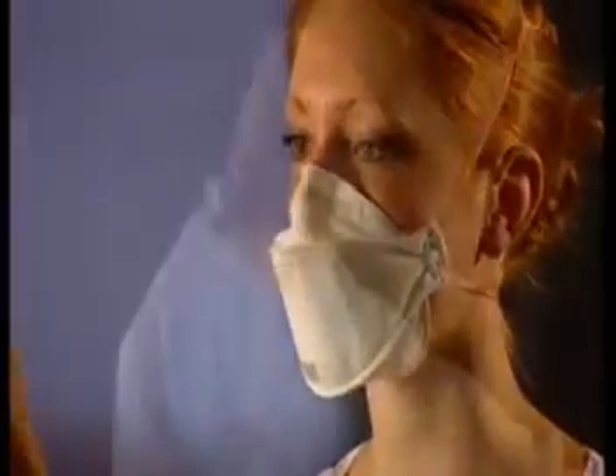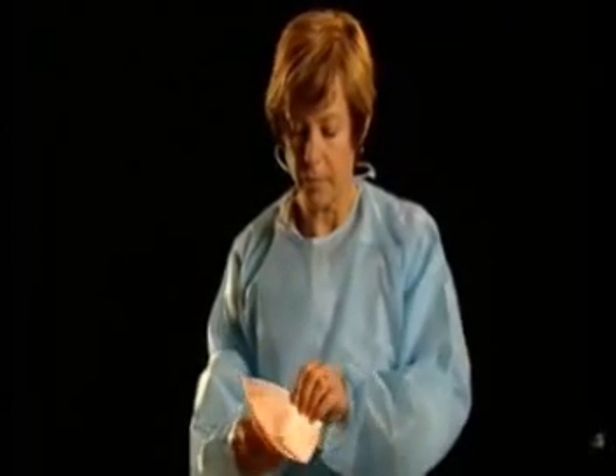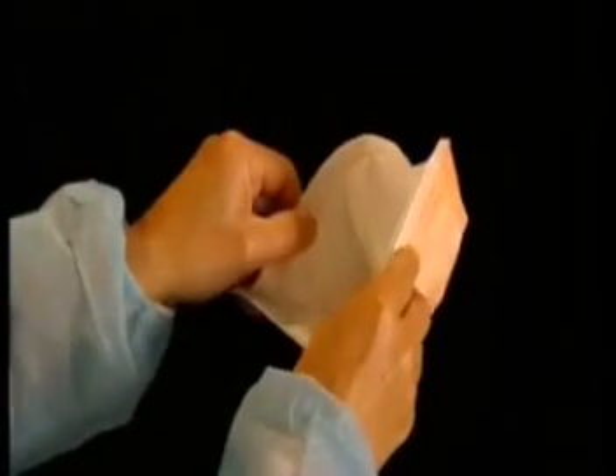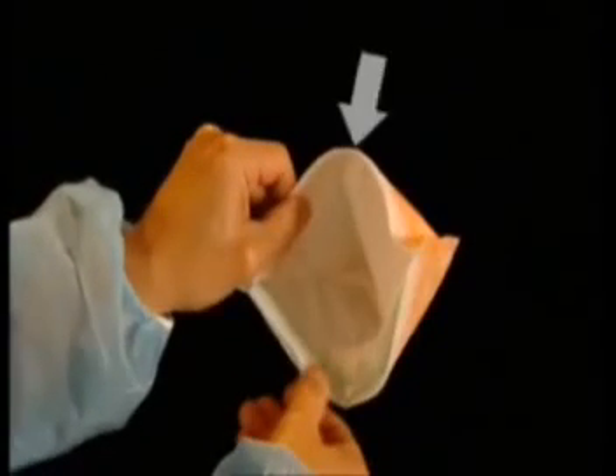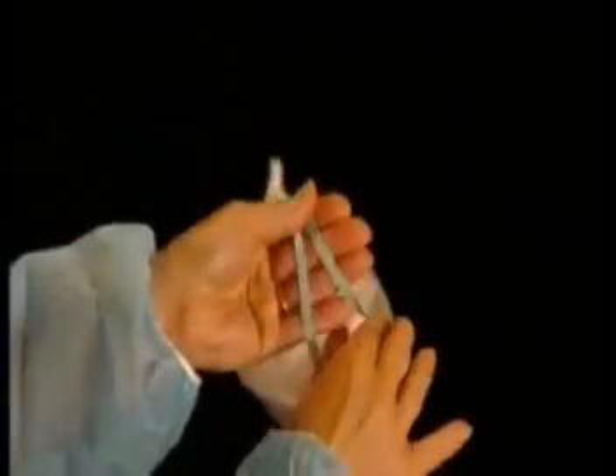Prior to putting on a P2 or N95 mask, check the mask for visible damage such as tears or holes in the filter material — if there is damage, discard and select a new mask. When using a flat fold mask, identify the top of the mask, which usually has a flexible bridge. Open the mask to form a round shape and gently loosen and separate the straps before putting on the mask.